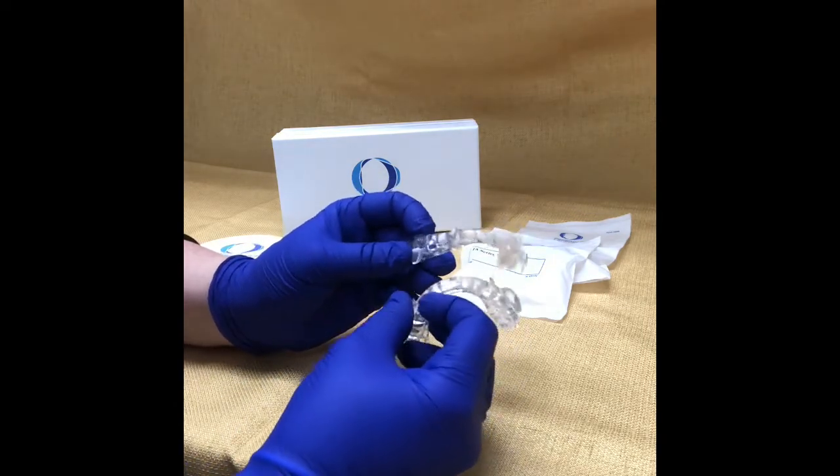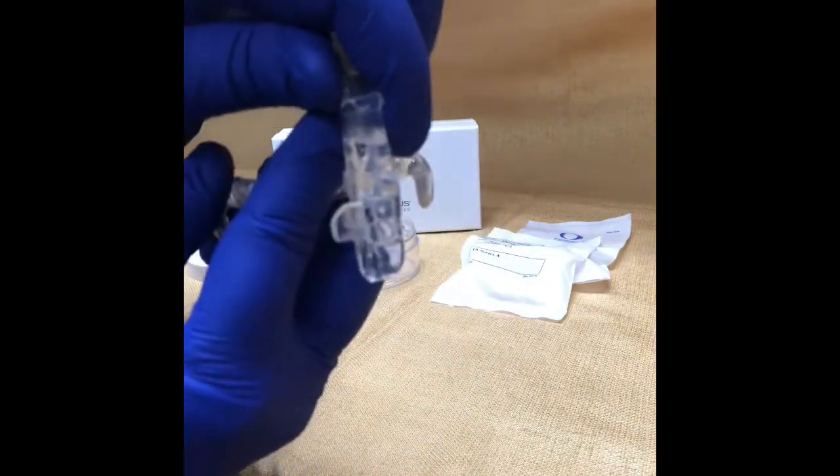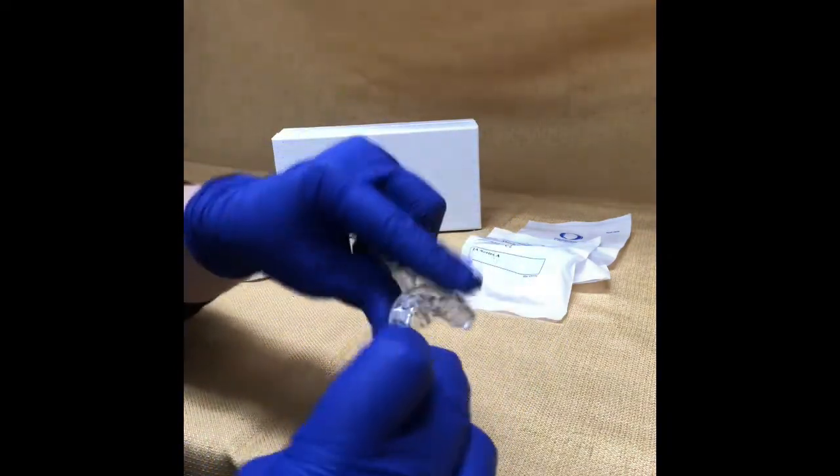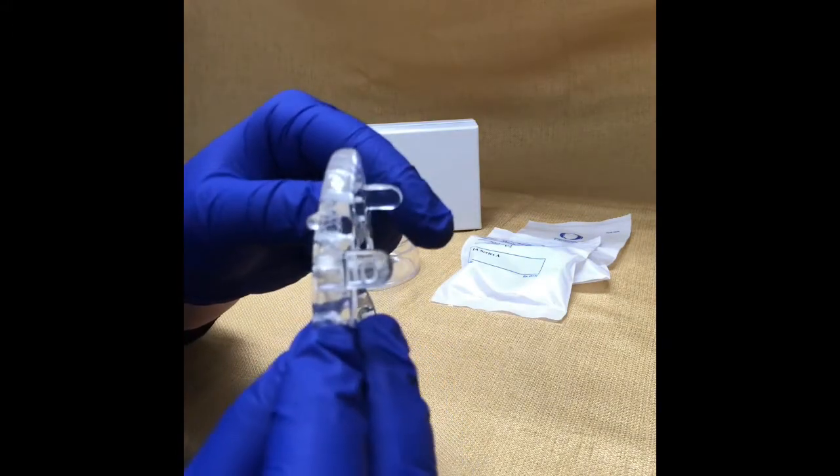These trays are always going to have a tray letter and number etched in the side of the wing. On the upper, it's always going to be a U and a number, and on the lower, it's always going to be an L and a number.